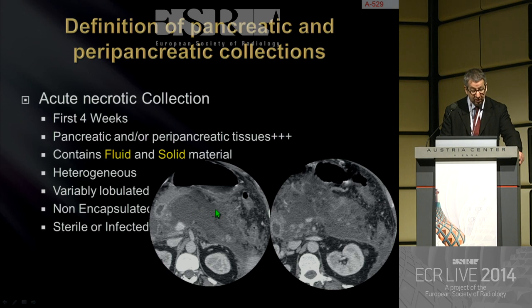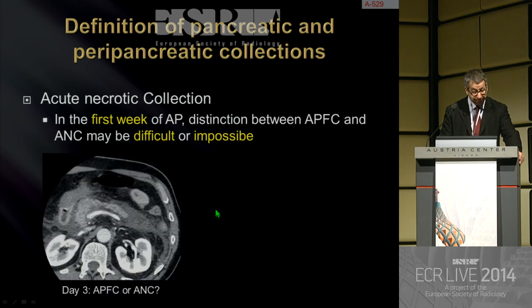It may be sterile or become infected. And to be clear, in the first week, and mainly if you do an early CT before 72 hours, it will be clearly difficult to distinguish between APFC and ANC.